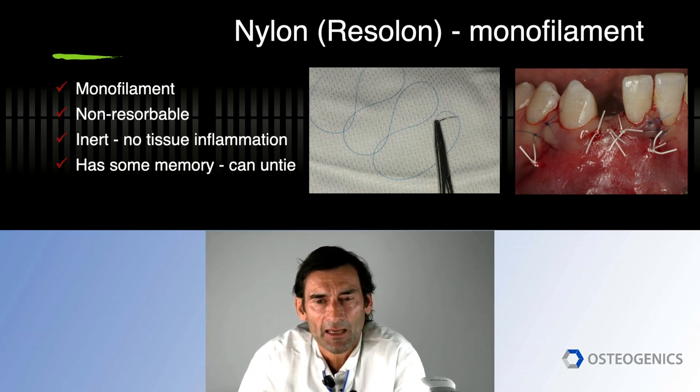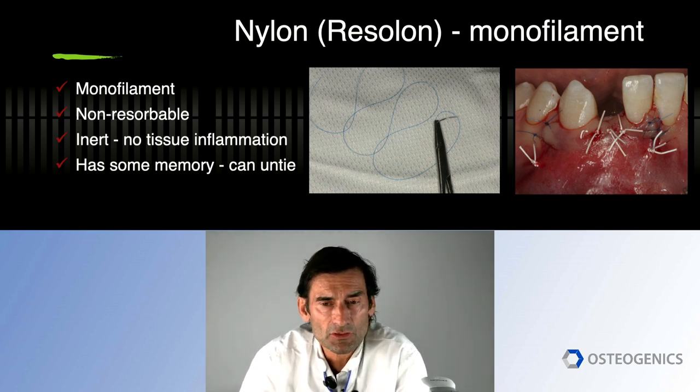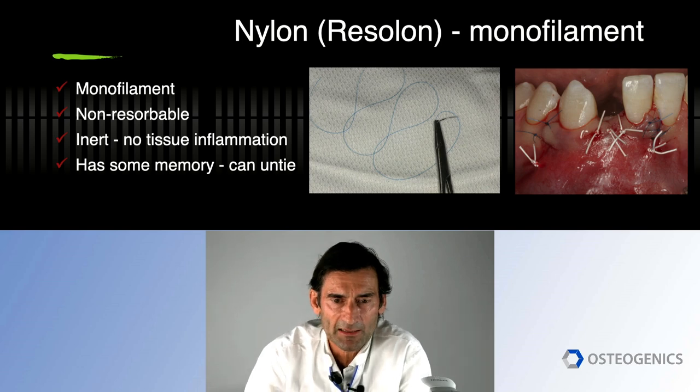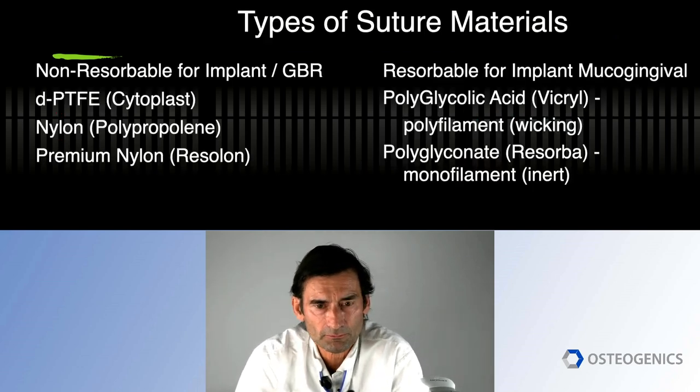They're also a little bit softer. So it really helps you if you like to use nylon, and I like to use nylon, for example, for vertical incisions, to use a material which is more premium, doesn't have that much memory, and is still soft for the patient. So, here's just a summary of this.